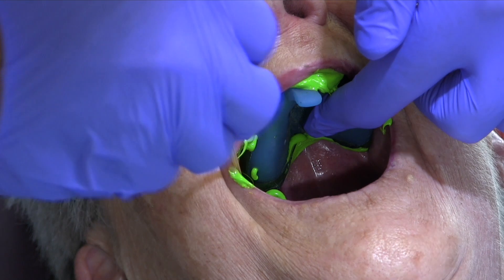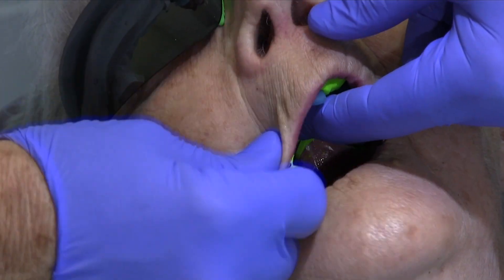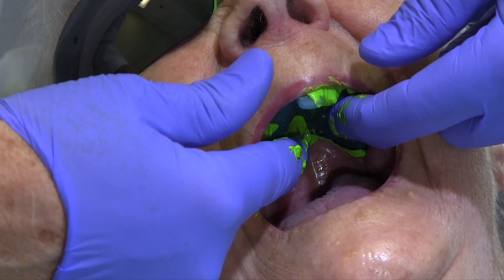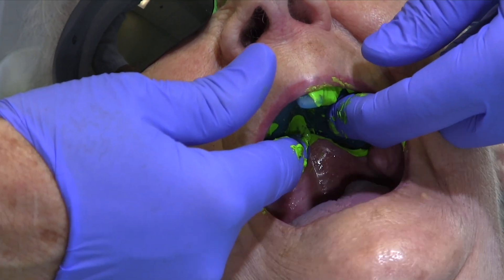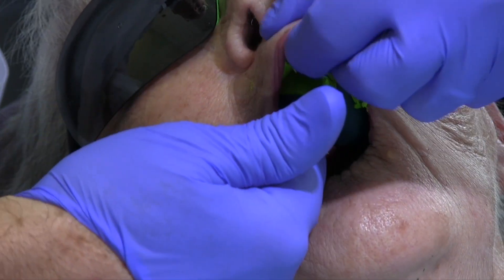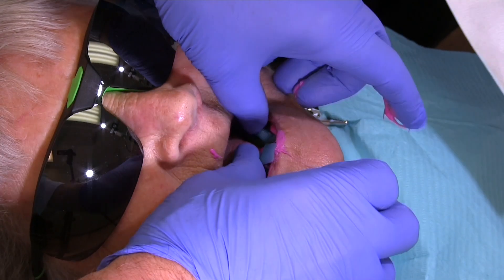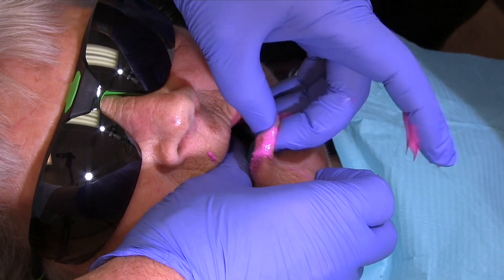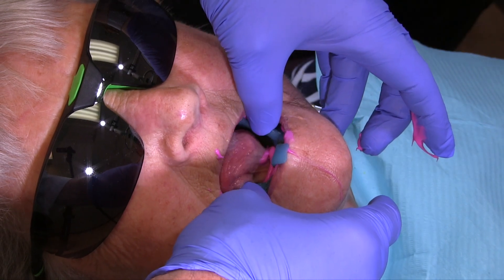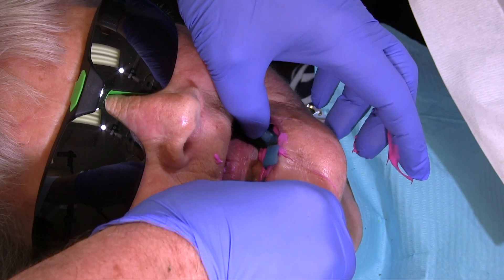After removing mirrors, use cotton swabs to quickly remove excess at the posterior borders of the impression to improve patient comfort. Then lightly border mold. In the maxilla, use circular and downward motions. Have the patient open wide and move their mandible from side to side to activate the pterygomandibular raphae and to mold the space available for the movement of the coronoid process. Exaggerate the outward and downward movement of the labial frenum to provide adequate relief for this important attachment. In the mandible, use border molding movements similar to that of the maxilla, including the exaggerated activation of the labial frenum. Additionally, have the patient lick their top lip from side to side to activate the lingual frenum and the floor of the mouth. Have the patient close lightly and briefly to activate the masseter muscle.